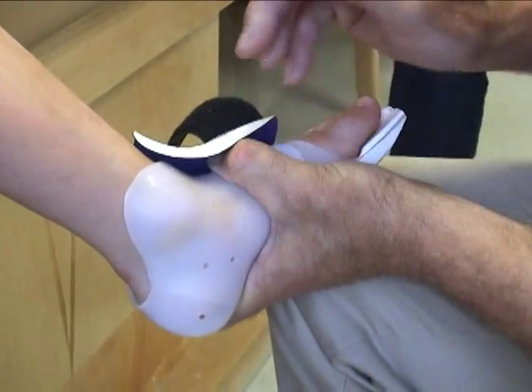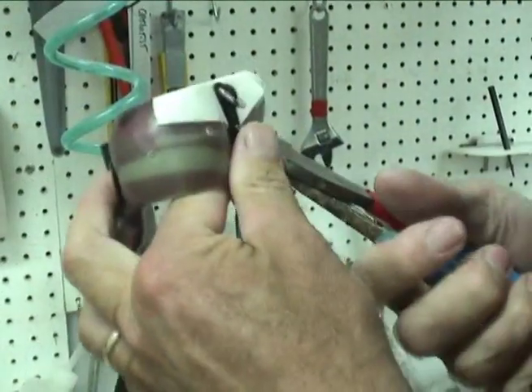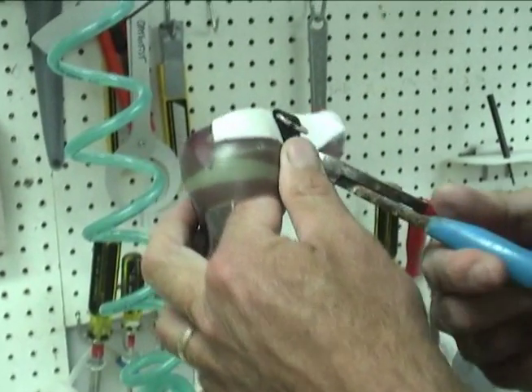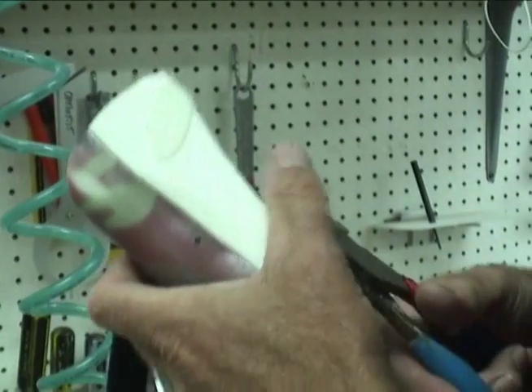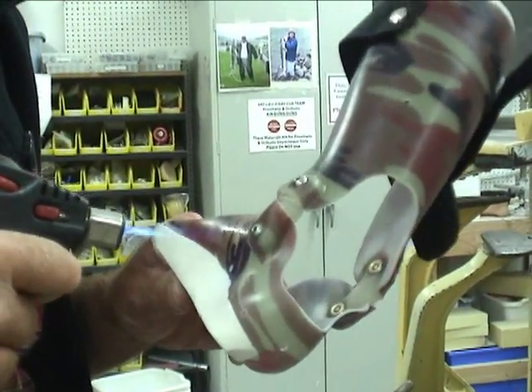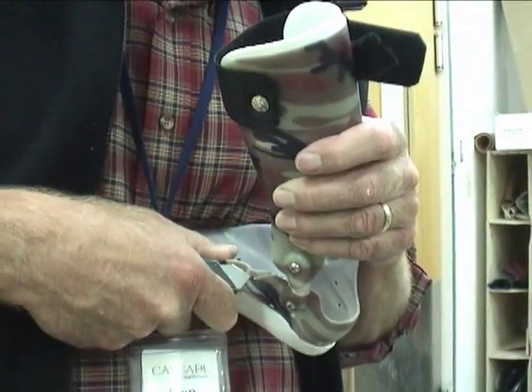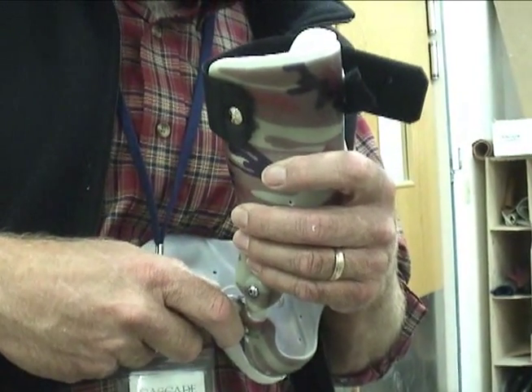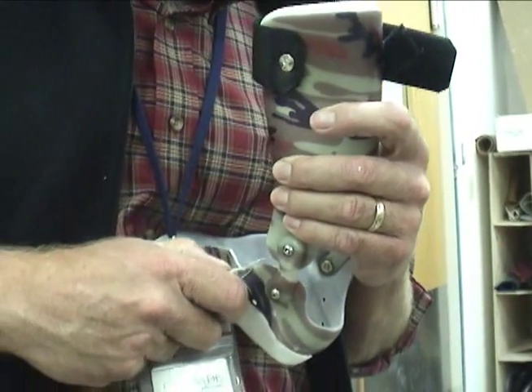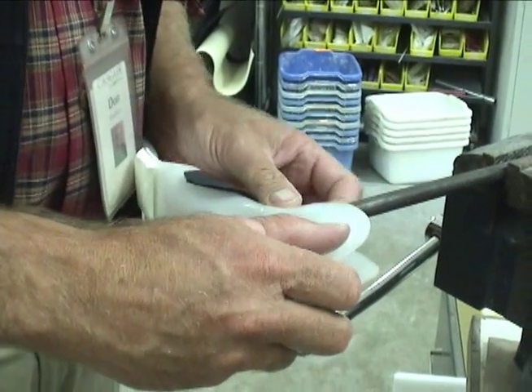This is a little bit challenging to adjust in that the instep strap D-ring is riveted to the frame of the brace very close to the area we're trying to adjust with heat. So the first step in gaining access to this area is to remove the rivet and the D-ring. This allows me to heat the plastic and push the frame out. I also trim down the frame to remove some of the structure in the navicular area. The purpose here is to allow the polyethylene of the inner liner to flex slightly as it accommodates pressure from the navicular.